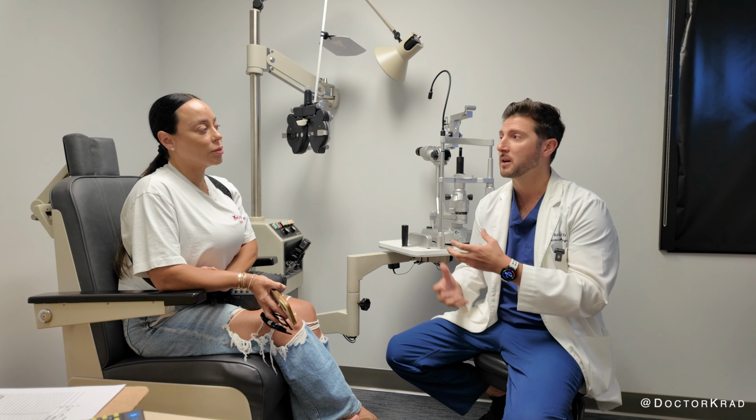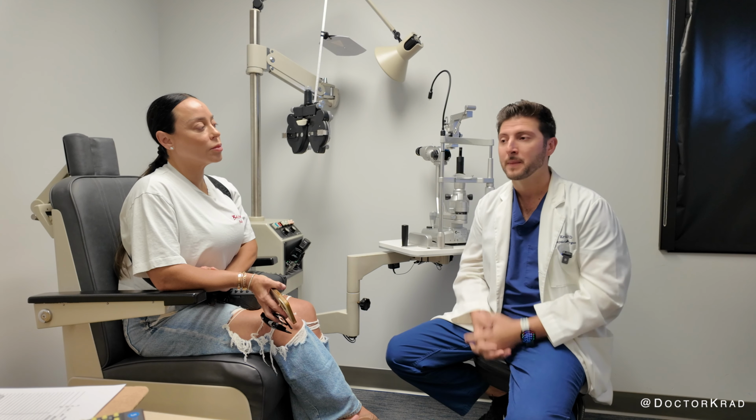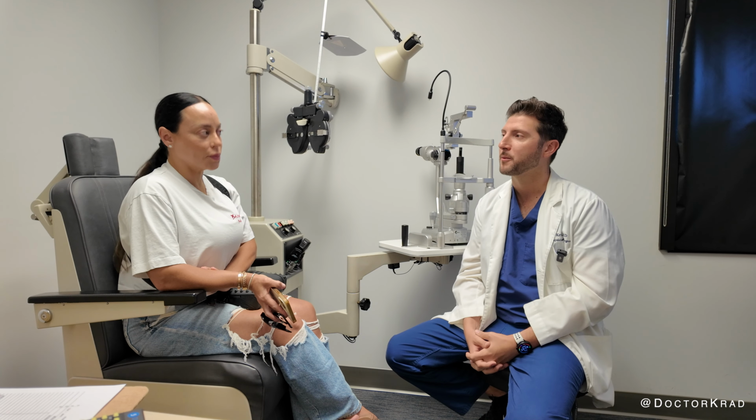And she was very reasonable with her expectations and said, look, if I can see good for far, I'm okay with readers. I just want to see well. And so we decided that exchanging the lens would be the best next step for her.